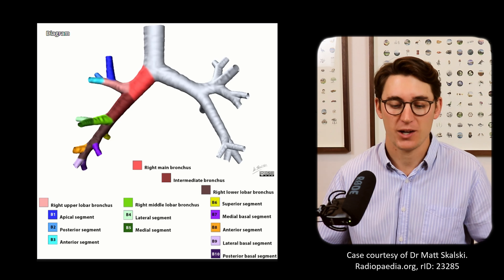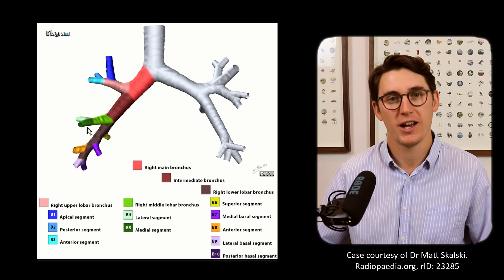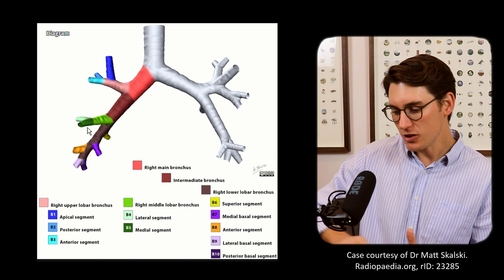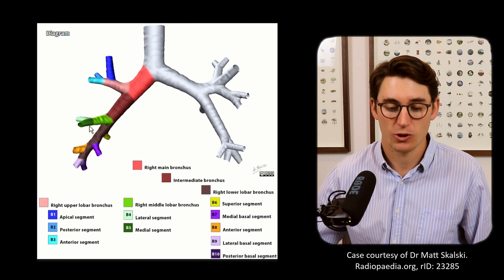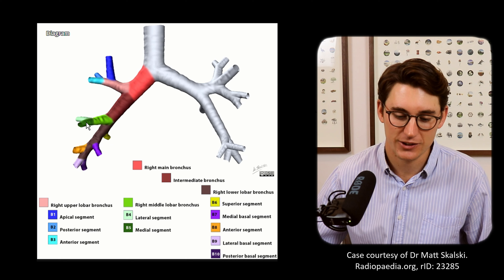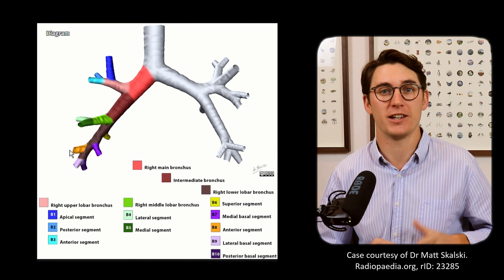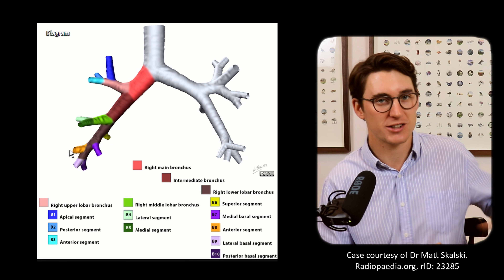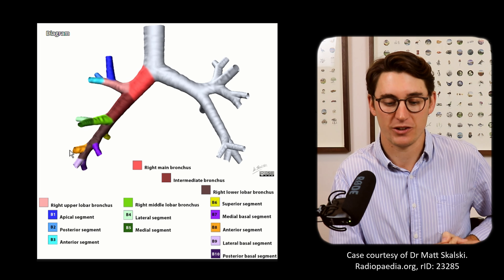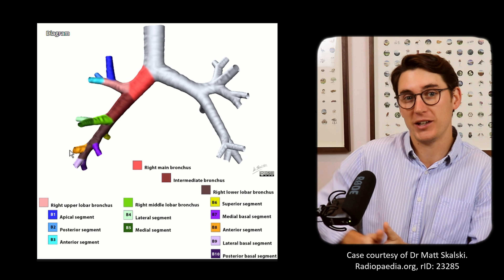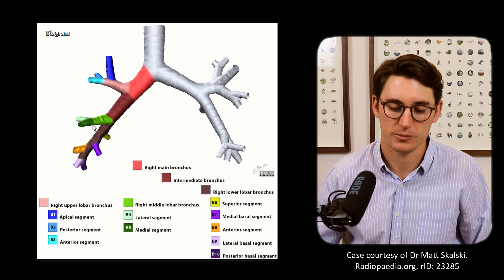The right middle lobe spreads all the way around the lung periphery, so we need a medial and a lateral branch coming off it. This contrasts with the lingular lobe, which doesn't spread all the way around, so it gets a superior and inferior division instead. Here on the middle lobe we need medial and lateral to cover the full extent.